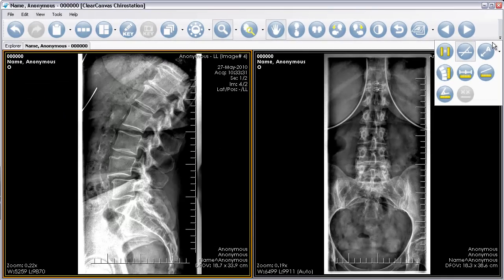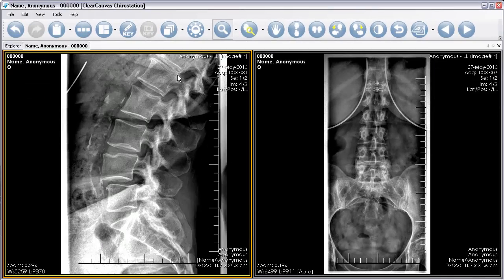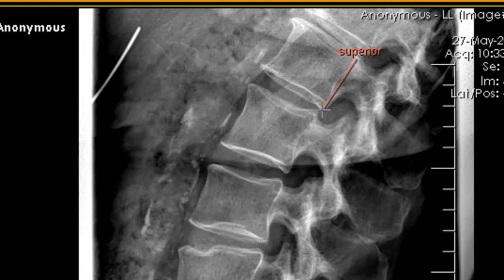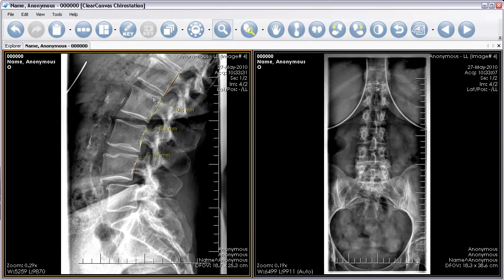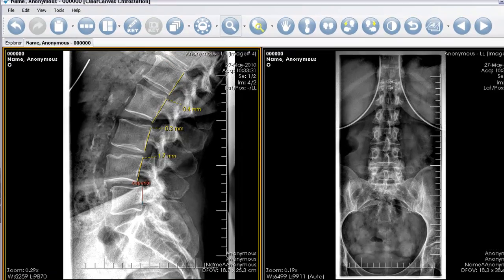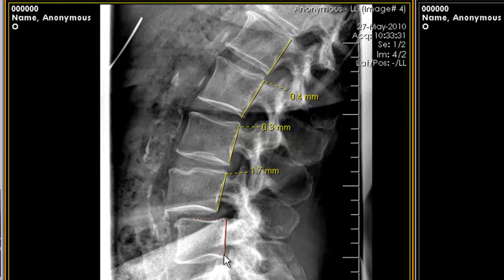To use the George's Line tool, select it from the toolbar. Mark each vertebrae like so. The tool will automatically show you the displacement of each vertebrae from the George's Line.